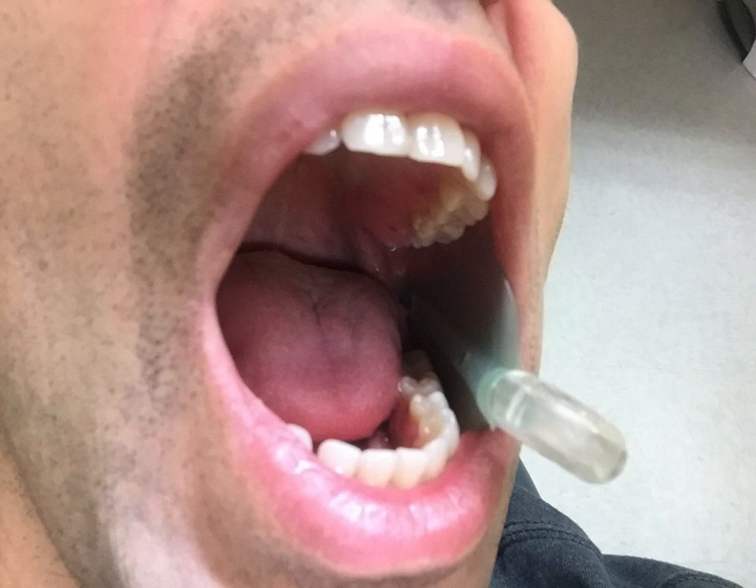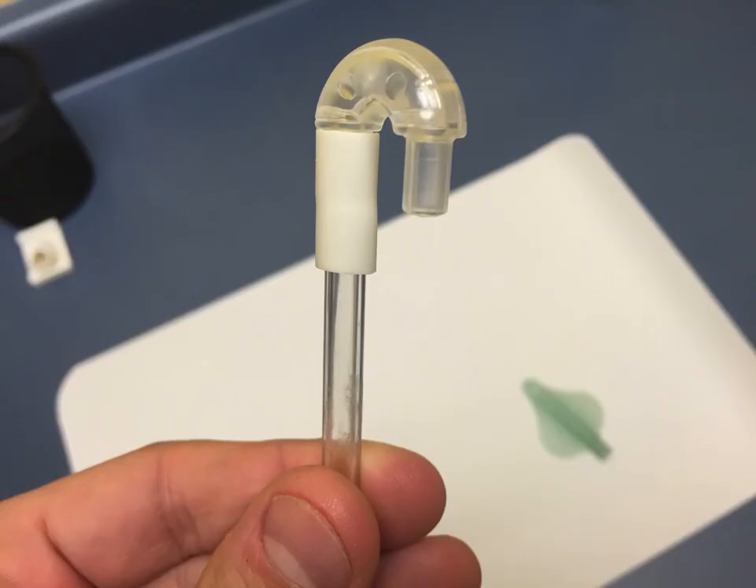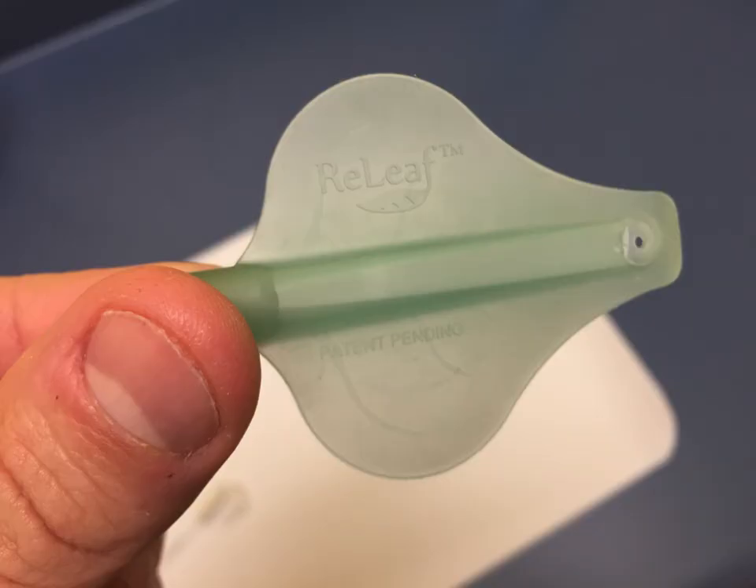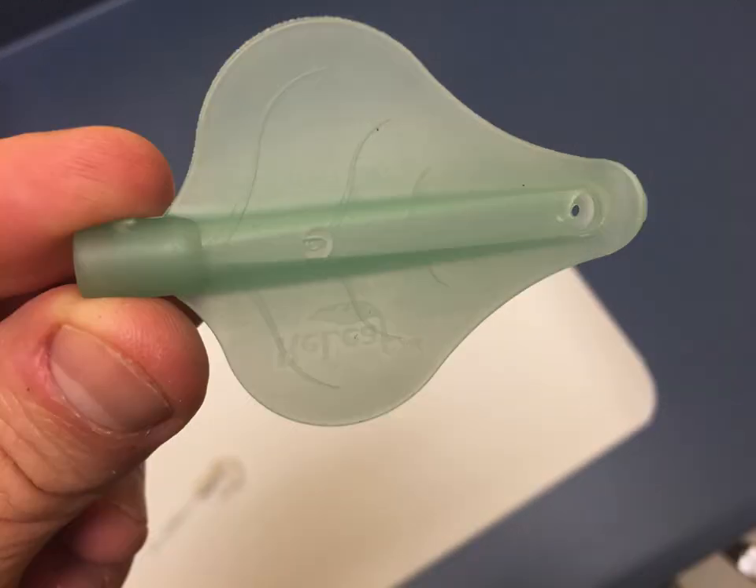The system has just two parts. One part is the tubing that slides into your saliva ejector valve, and the other part — the short tubing — is where the green leaf-shaped suction piece slides onto. This is the part that goes against the patient's cheek, and it's the disposable component.